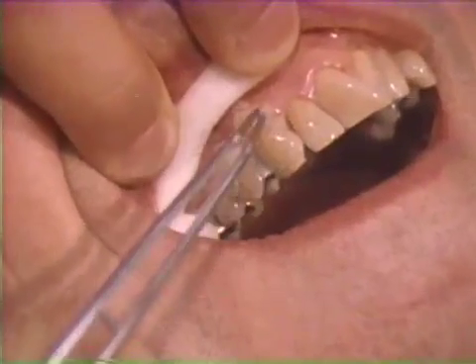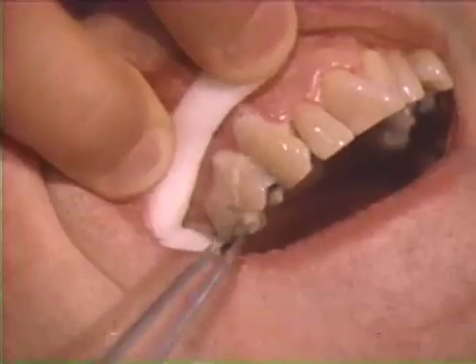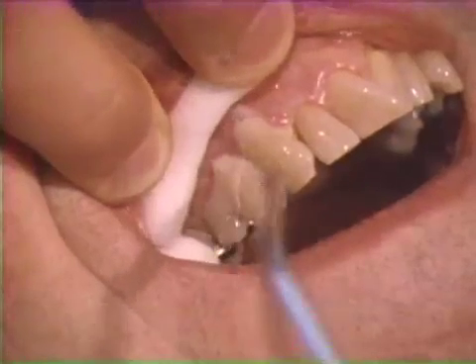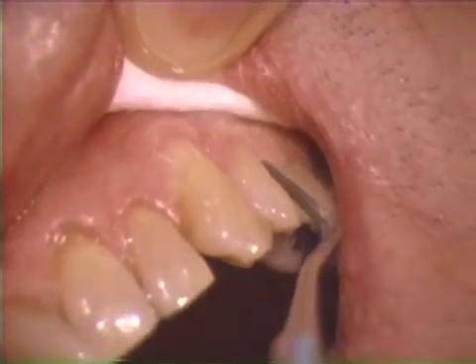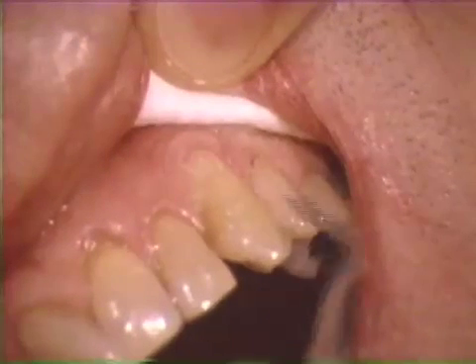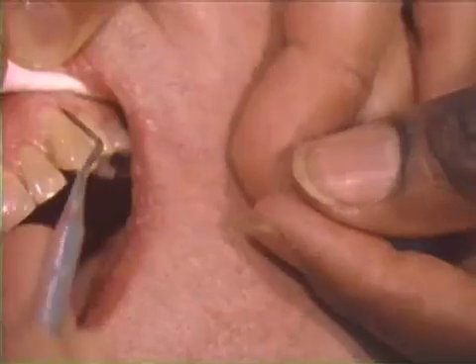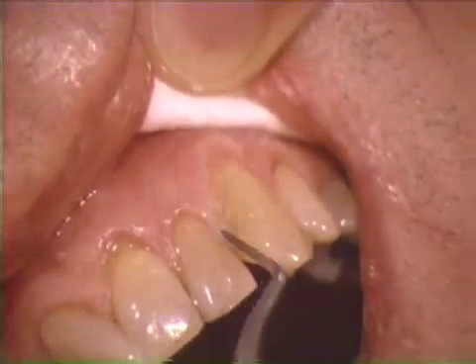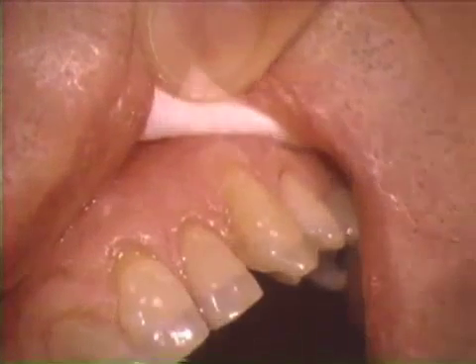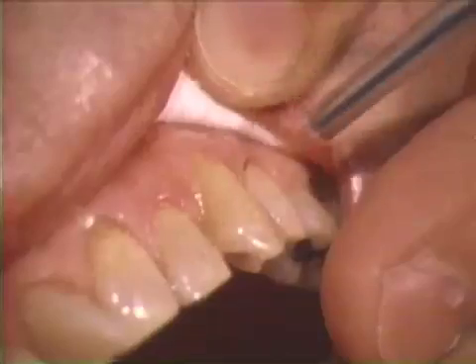After the glass ionomer restorative material has reached its initial set, it must be covered with two coats of special varnish, allowing three to four minutes of drying time for each application. When dry, the varnish will not flow under a gentle stream of air. Another contouring method is demonstrated in the patient's contralateral arch. The restorative material is contoured and carved with a suitable instrument that has been liberally coated with cocoa butter. The assistant should reapply the lubricant to the contouring instrument during this procedure. It should be emphasized that contouring must be completed before the material reaches its rubbery stage of set. The restoration must then be covered with special varnish after it sets.